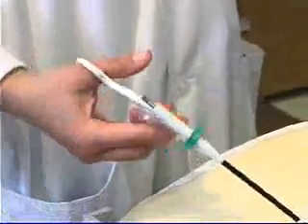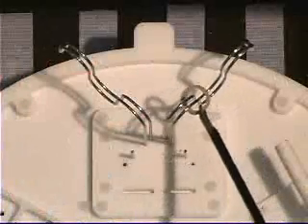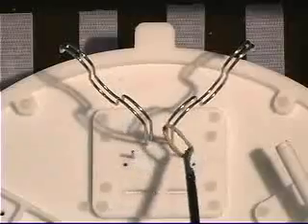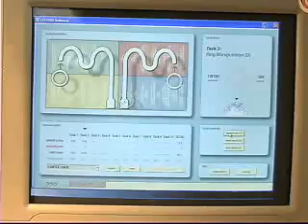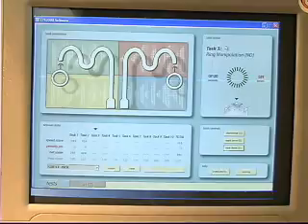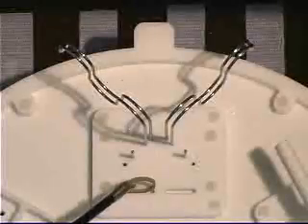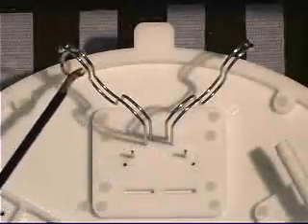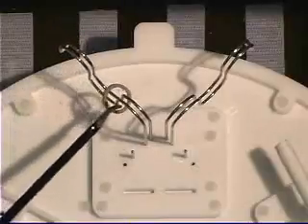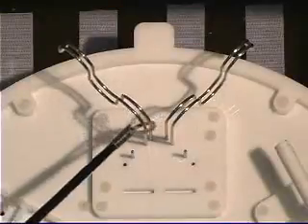A buzzer will sound each time the ring contacts the post. The task is completed when the ring is stretched over the pin for a total of 3 seconds. 10 penalty points are assigned for each time the ring is dropped, up to a maximum of 30, and 10 penalty points are assigned for each 1 second segment of contact between the ring and the post for a maximum of 60. The cutoff time for this task is 120 seconds. This procedure is repeated with the non-dominant hand on the other side, as is demonstrated here.